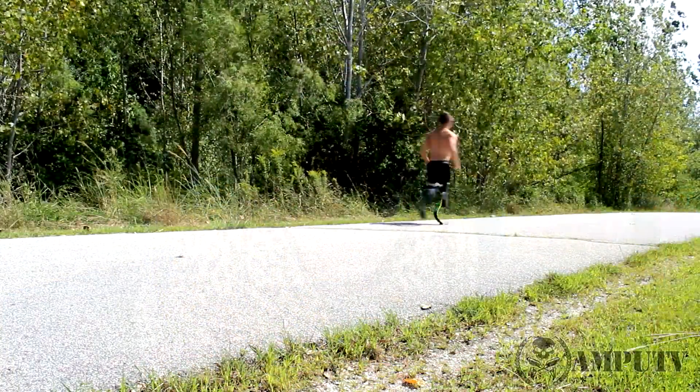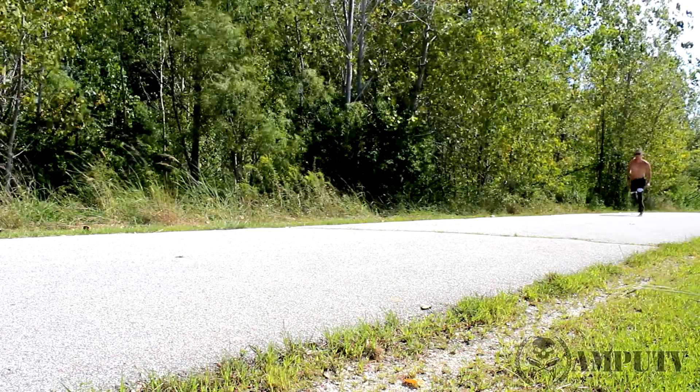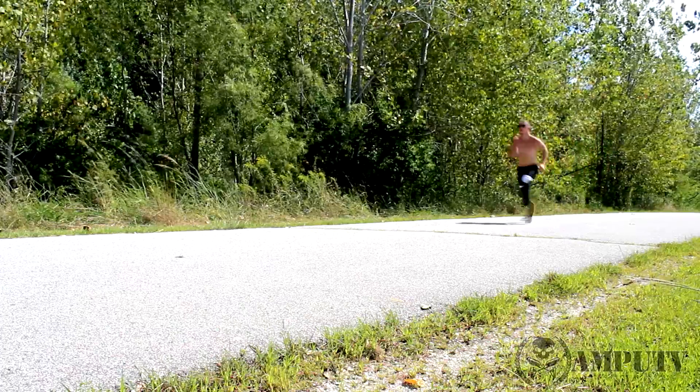Studies have been done on this — you can Google 'are running blades an advantage.' The best way to put it is that these even out the playing field. Without a running blade it feels like running on peg legs, so these are a lifesaver. I can run with my walking legs but it's not comfortable — it feels like stomping on the ground with peg legs. But when I run with these it's a totally different feeling. I seriously feel like I actually have feet and I'm actually able to run.